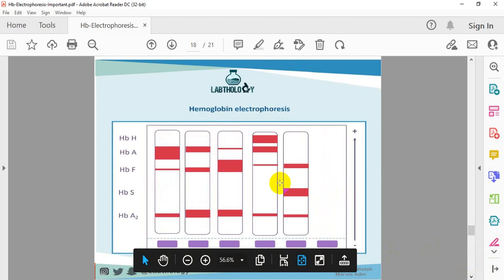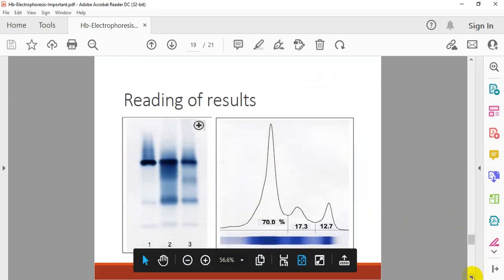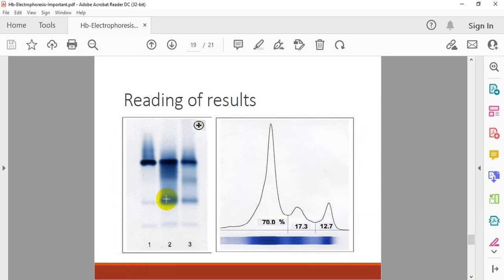So this is another hemoglobin electrophoregram. Go through and see whether you understand it. We have results 1, 2, and 3 for patients 1, 2, and 3. This patient has only one band, so if it is AA, then it's AA. This patient had 2 bands, one here, one here, so this patient can be AS or anything. This patient also has 2 bands. But this is just an example. The third one is not clear.